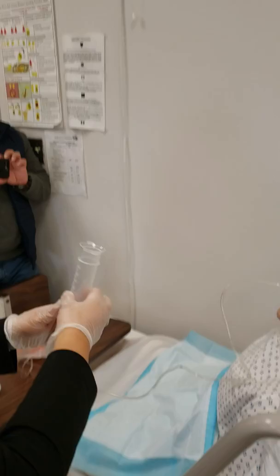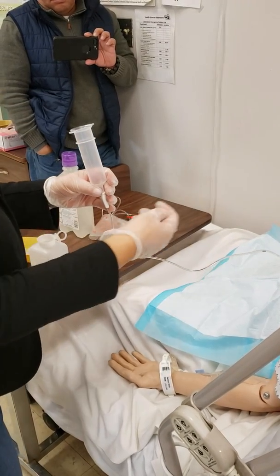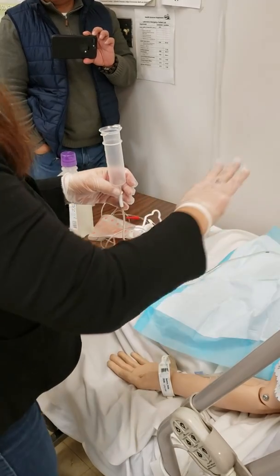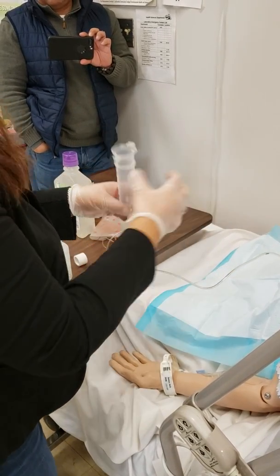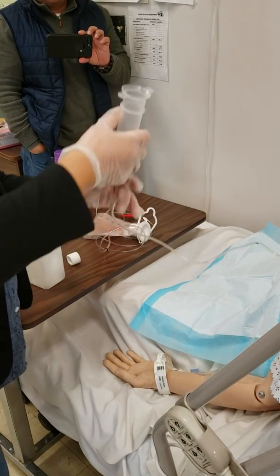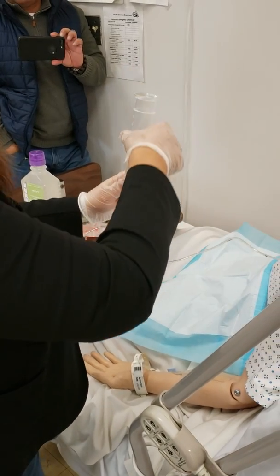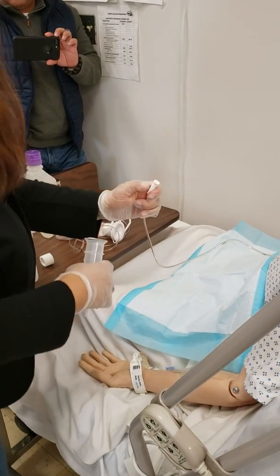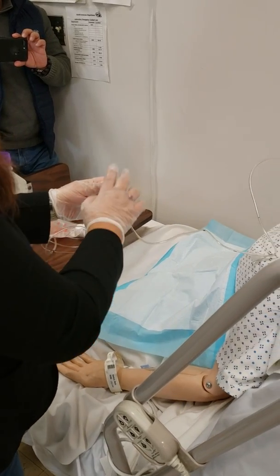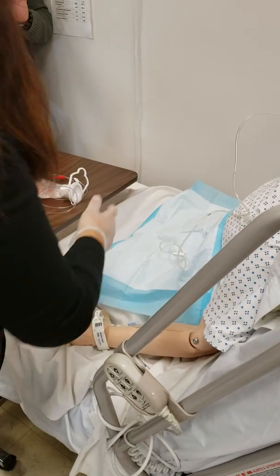Because when you aspirated, you might have taken some solid materials up there, and if you don't flush it, it's going to dry and might clog the tube. So you have to flush it after aspirating. After flushing, you will cover it again with an imaginary cover. Leave it there, and you're going to prepare your bag.